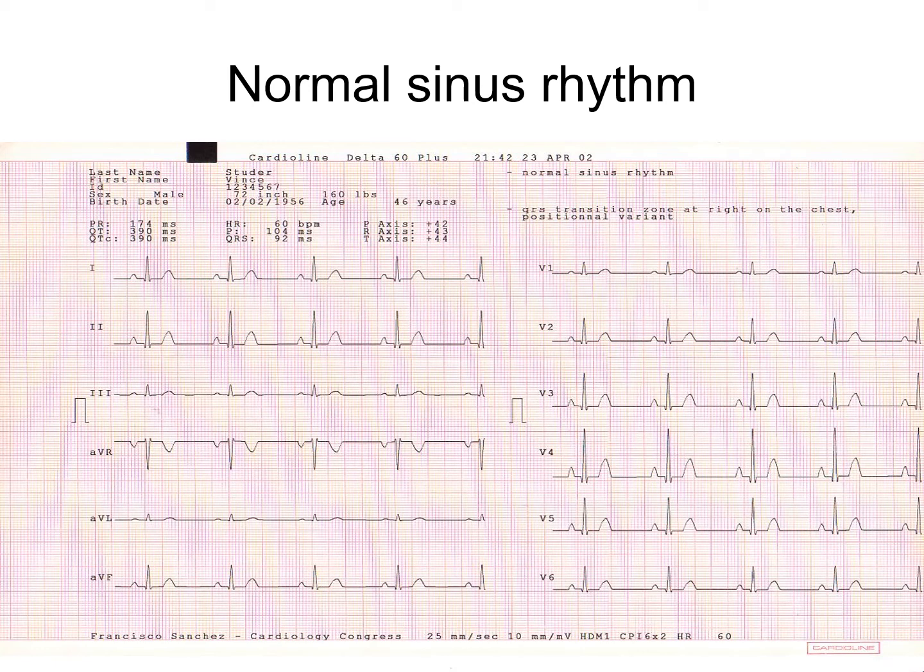So here's an example. We're asking ourselves then, is there a P wave for every QRS? Yes, there is. Is the rhythm consistent? Do the QRS complexes look normal? So you can see in lead 1 and lead 2. The Roman numeral 2 is the one they most likely look at. Those are the more common leads that they interpret the EKGs with for most things.